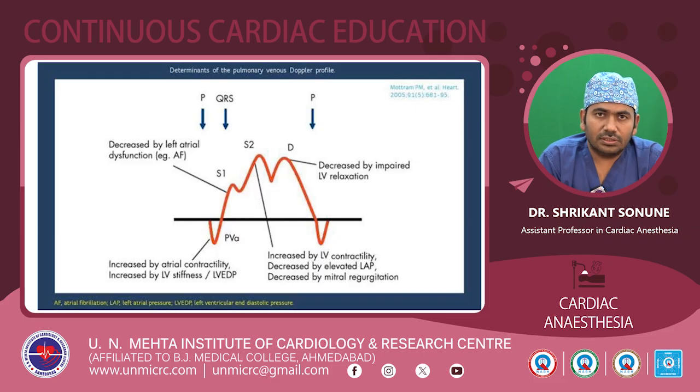These are some of the variations which can be seen in the pulmonary vein Doppler waveform. An increase in the amplitude of the A wave can be due to increased atrial contraction, increased LV stiffness, or increased LV EDP. A decreased amplitude of the S1 wave can be due to left atrial dysfunction, which is more commonly seen if the patient is in atrial fibrillation.